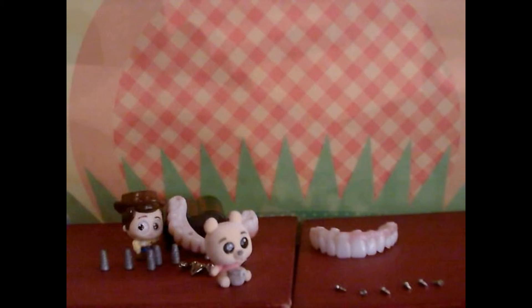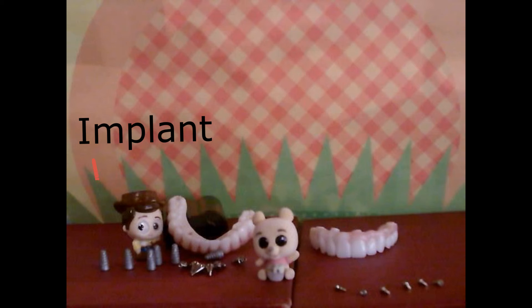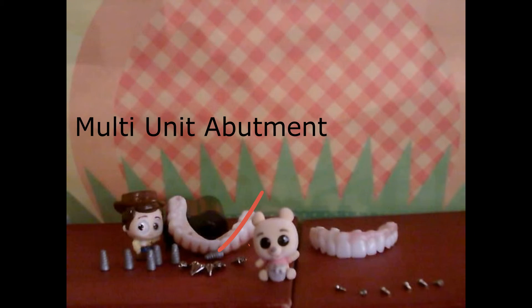Hey guys, it's Winnie the Pooh here. I just want to tell you a little bit about our screw dentures. First, we have our implants right here, and next we have our multi-unit abutments.